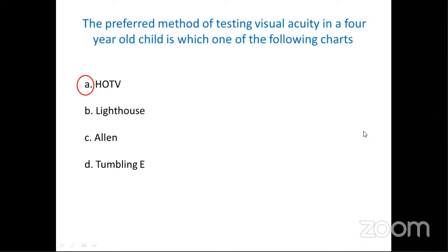They are not able to speak, they are not able to write. Physically challenged kind of children, mentally retarded kind of children. They can see properly, but they are not able to start a conversation, they are not able to give you any response. For those kind of children, they can easily match the visual acuity, right? So in those cases we can use HOTV.